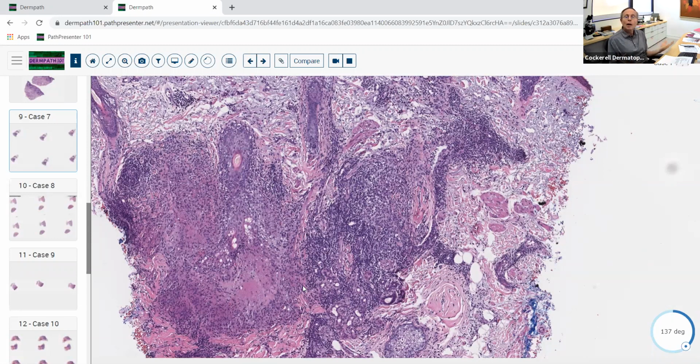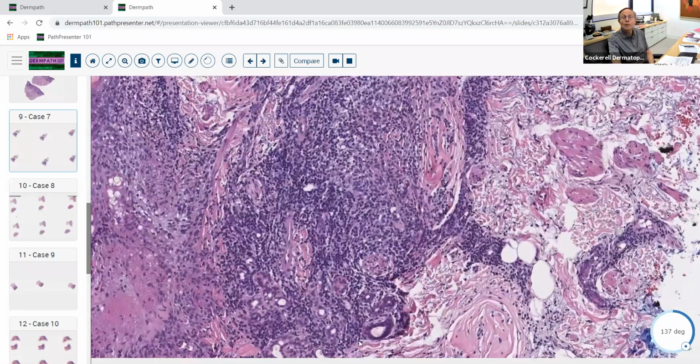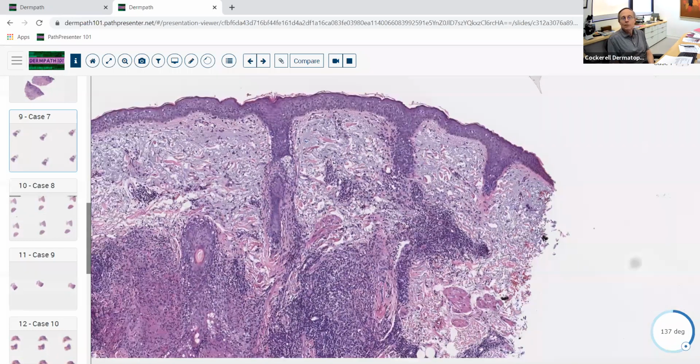And so guess what? People biopsy rosacea to rule out lupus. You don't want to overcall it as lupus. We see a lot of that where people will call this pattern over here without the granulomatous inflammation, calling it consistent with lupus or lupus. And then the patient, once they get a diagnosis of lupus, it's like the scarlet letter L that's branded into their skin. They carry it around with them forever. And they think that they have lupus and they tell everybody, I've got lupus. Well, they don't have lupus.